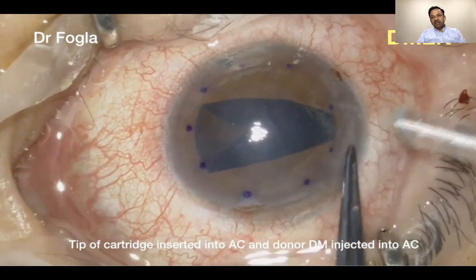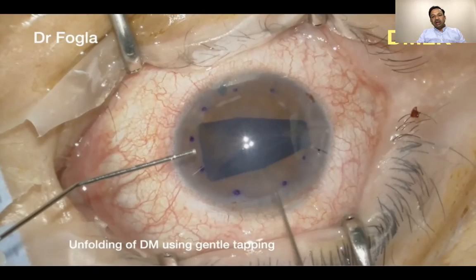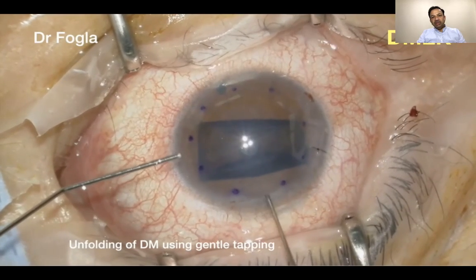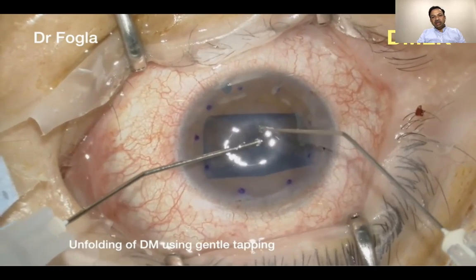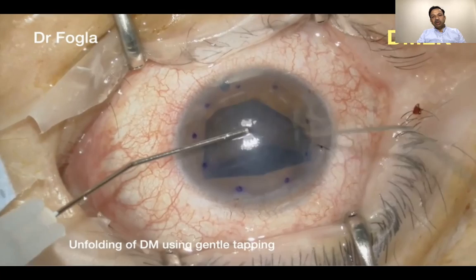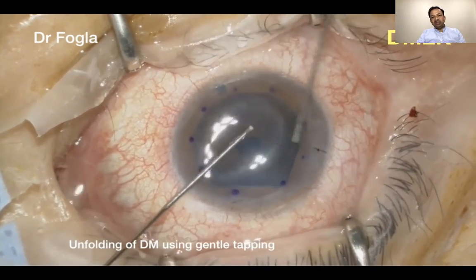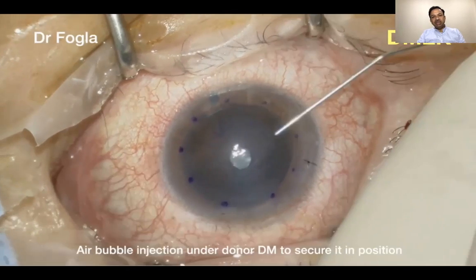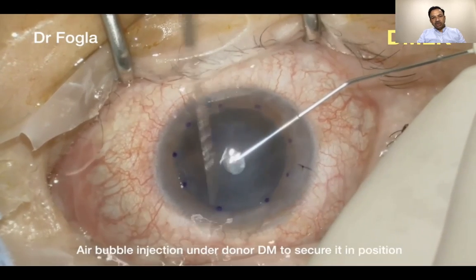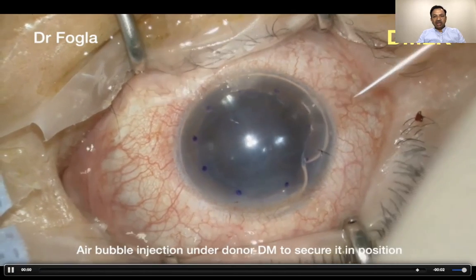And here you can see that the donor has been inserted into the eye. This is a case of Fuchs dystrophy. Once the wound is secured, using a no-touch technique, just by surface tapping, you can get the donor DM scroll to open up. When you tap the surface, you create fluid waves in the anterior chamber, and the fluid waves, by their motion, help open up the graft. You can see the S stamp on the donor graft, which tells us that's the right orientation. And you put a large air bubble, which secures it in position.